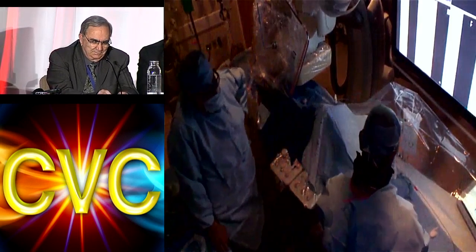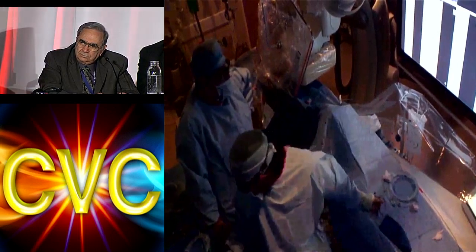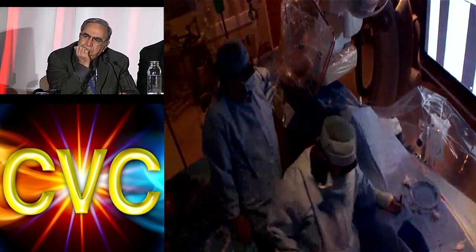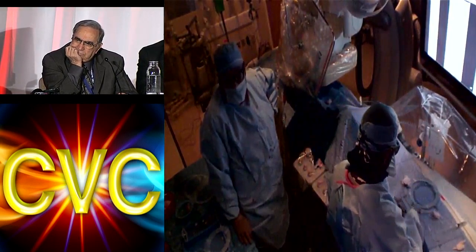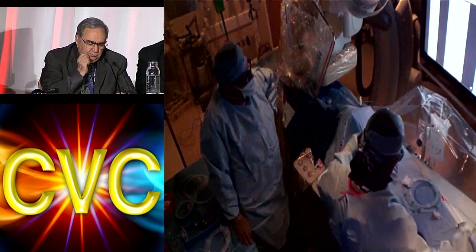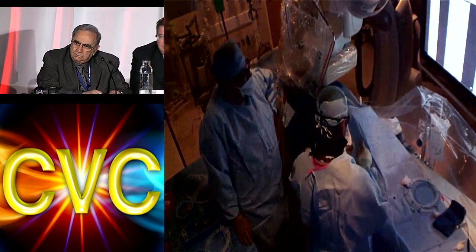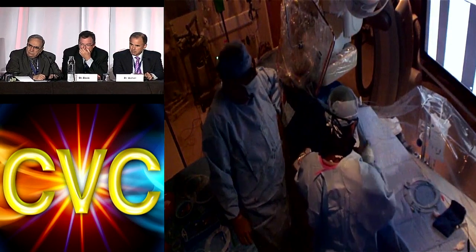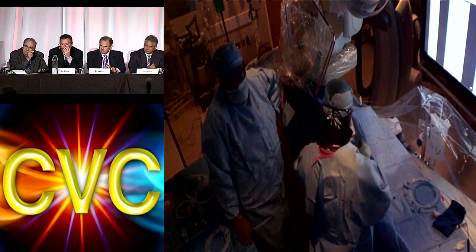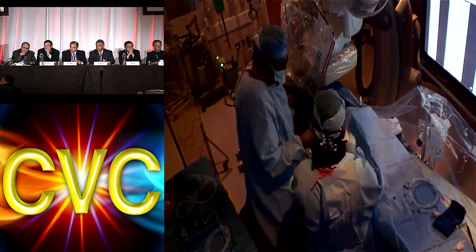Well, we haven't gained a whole lot. We decided, I think the two best options now are to either go from above with a CTO device or stick him in the foot. I think we're going to go ahead and try Wildcat from above. But knowing that we definitely got at least two good options from below, that if we have any issues from above, there's no reason to push it. I think we could wire this from below a lot easier. What do you guys think?